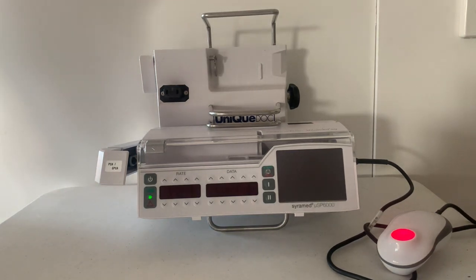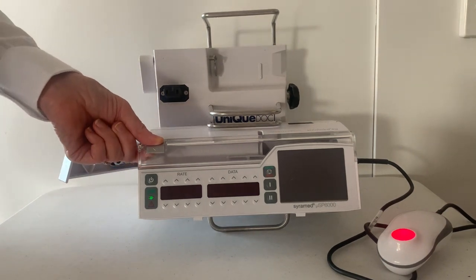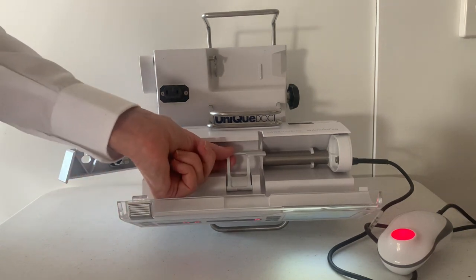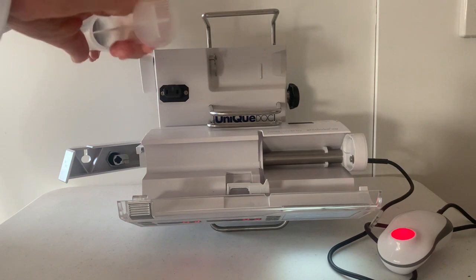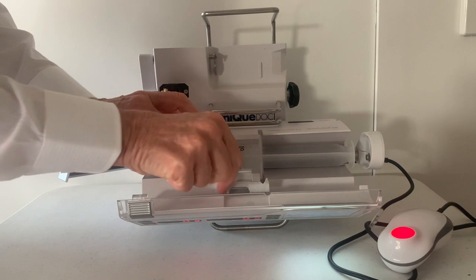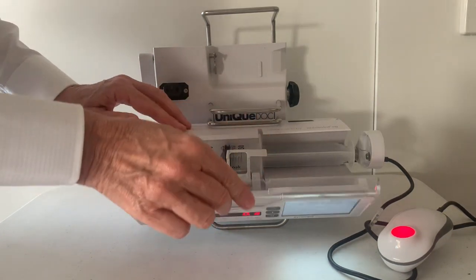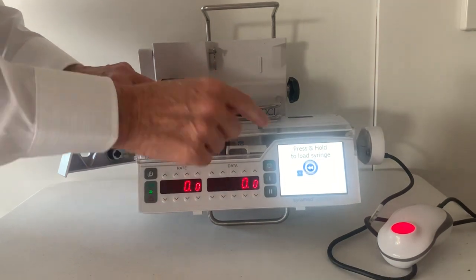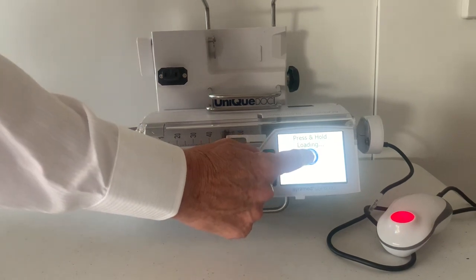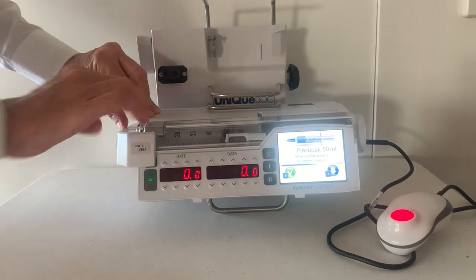Now I'm going to load the syringe. Open the arm. Use your grip to pull the door forward — the pump automatically turns on. Open the clip. Place the syringe so that the flange is flat and sitting in the groove. Close the clip over the flange and close the door. Follow the prompts on the screen: press and hold to load syringe until the syringe is engaged. Lock the arm.